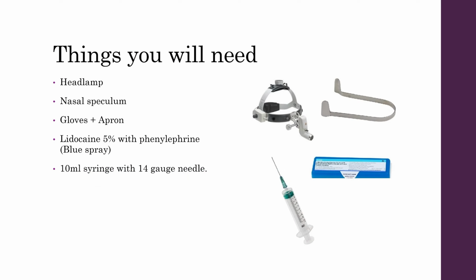Things that you'll need in assessing patients are a headlamp, a nasal speculum, gloves and apron, the blue spray, which is the lidocaine with phenylephrine, a 10 ml syringe with a 14 gauge needle.